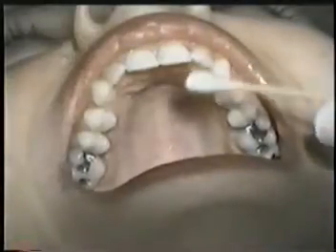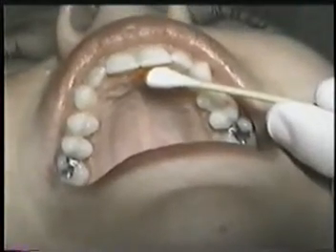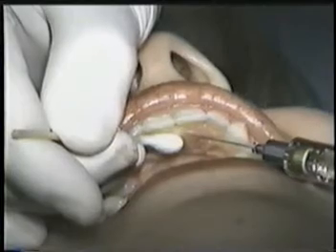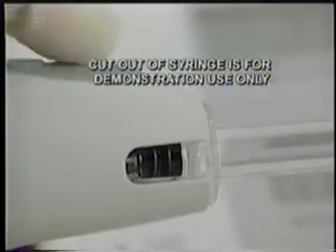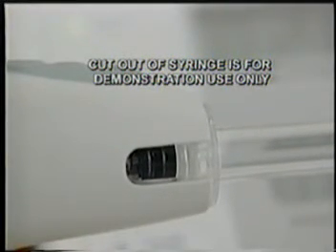You do not need to alter your chosen standard techniques for positioning or preparation of the site when using the CCS. As with your traditional syringe, position the needle at the site and slowly insert. If the chosen injection requires aspiration, press the aspirate button. The plunger will retract a short distance. Again, the CCS's clear plastic holder gives you full visibility of the cartridge.